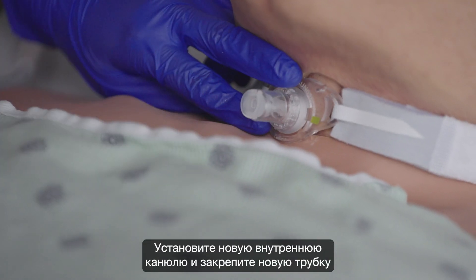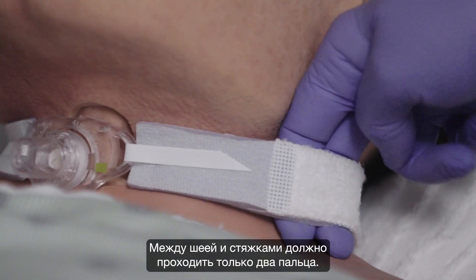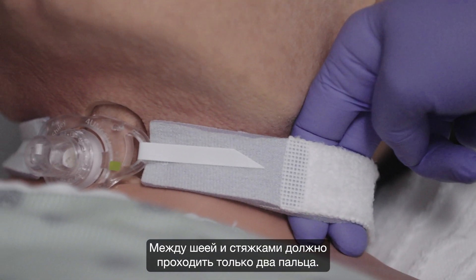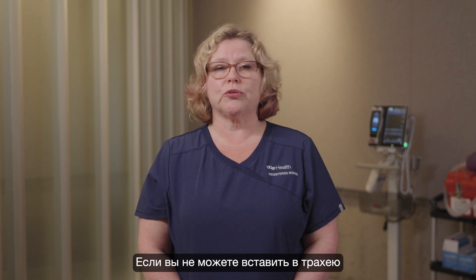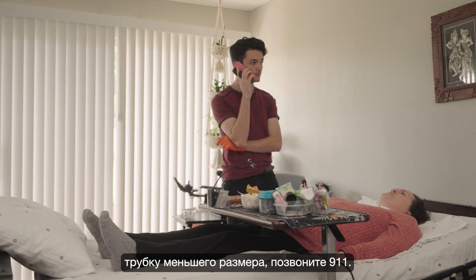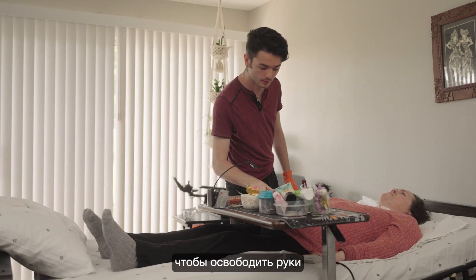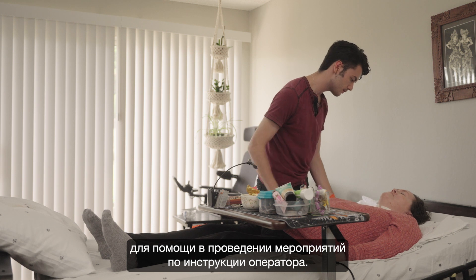Place the new inner cannula and secure the new tube with a trach tie. Leave only enough room to place two fingers underneath. If you are not able to reinsert the smaller trach, call 911. Place the call on speakerphone so you can have your hands free to help with interventions as instructed.